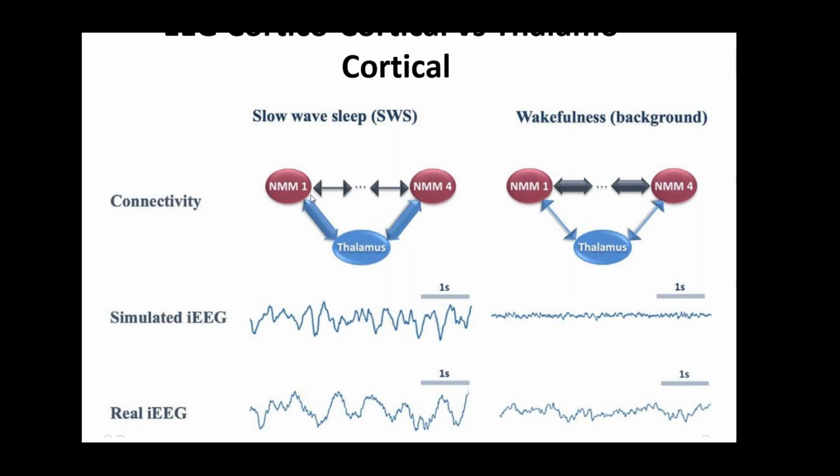All right. And if we do this in a patient during the awake state, this thalamocortical network becomes very small, with the predominance of the cortical networks very strong. Again, remember the small networks only allow to produce fast frequencies.